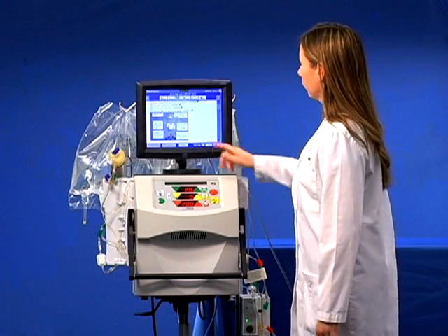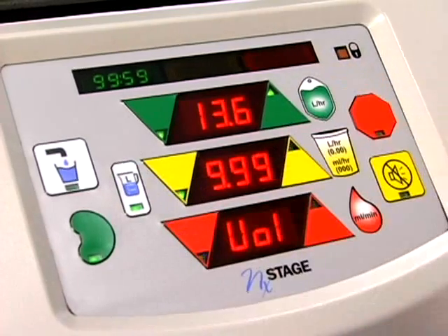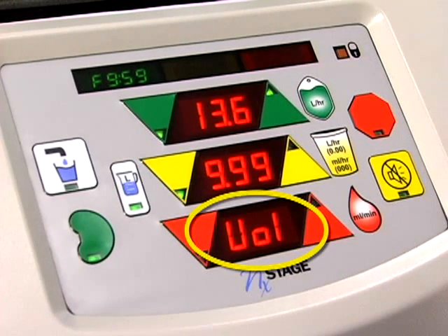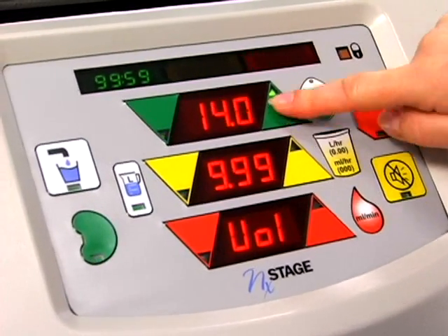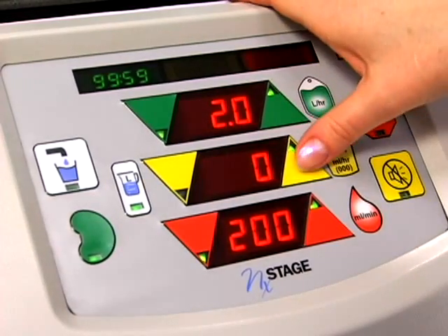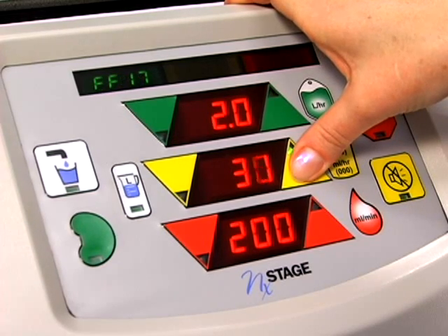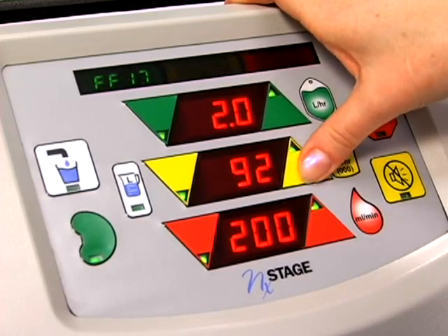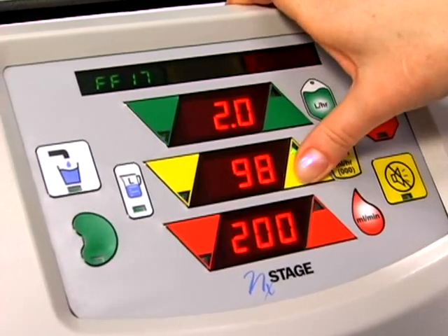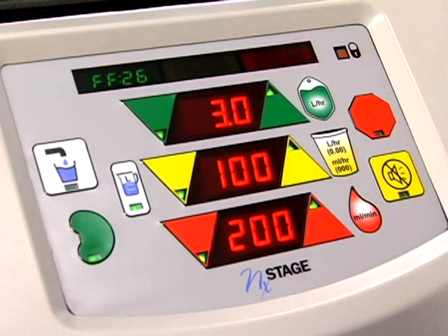Click the program button to program your treatment settings. Press the volume toggle and observe VOL in the bottom window. Enter the therapy volume goals. Make sure that you see VOL in the red window when entering the volumes. Press the volume toggle to return to the rates display, or the rate display will reappear if the buttons are not engaged for 10 seconds. Adjust your therapy rates. This completes the section on programming your treatment settings.